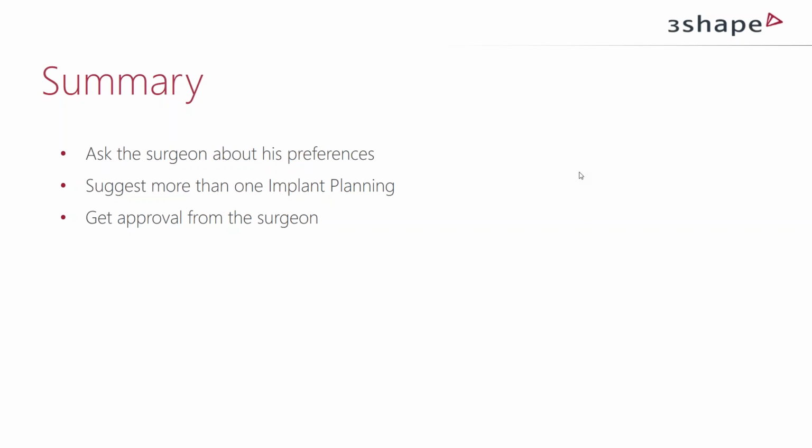So I think talking together here is key, or communication is key between the different parties, and definitely making sure that you're on the same page, I would say, is key.